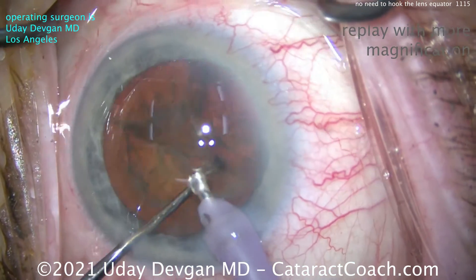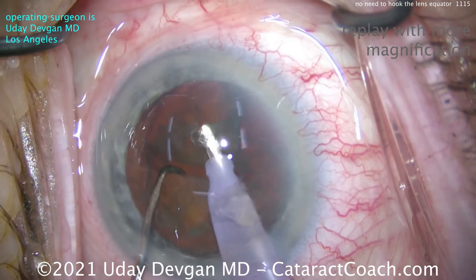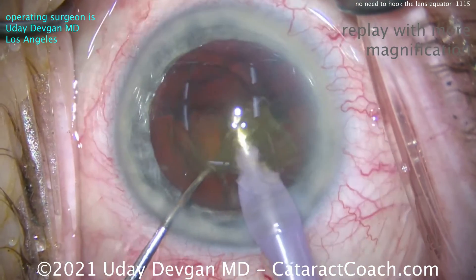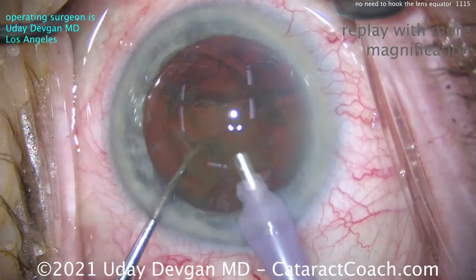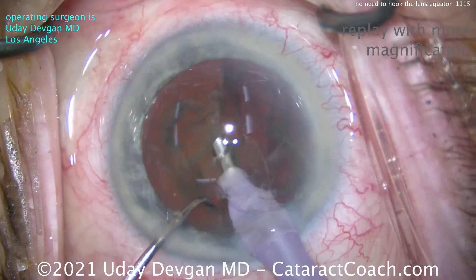Rotate around to get that other quadrant out. Then that last half will chop again — make sure we have good separation. Bring this quadrant up to right about the iris plane. We don't want to ride the endothelium when doing this; you want to be just at the iris plane. Then take that down.